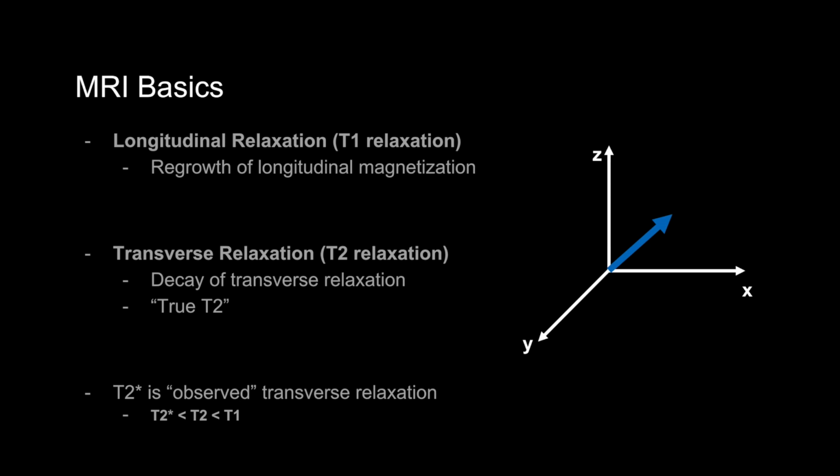Any magnetic field inhomogeneity will result in some protons that experience higher field strengths and others with lower field strengths. The ones with higher field strengths precess faster than the other ones. If that happens, there will be a resultant loss in signal in the transverse plane very quickly, because the transverse magnetization depends on precession remaining in sync.